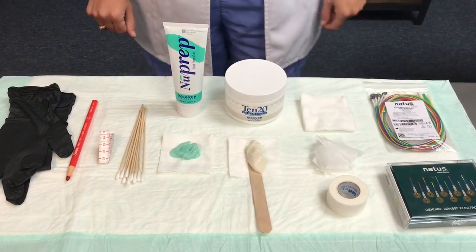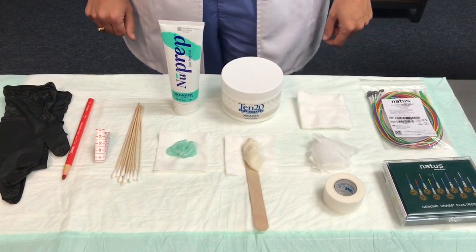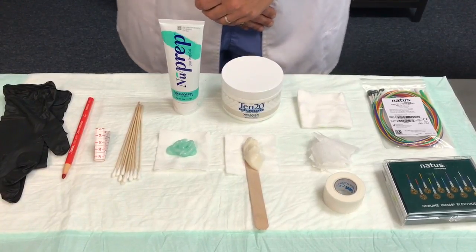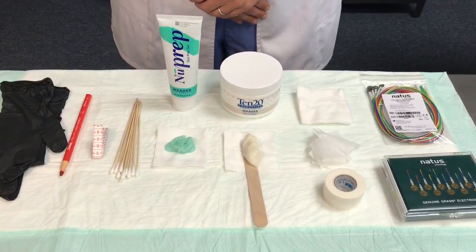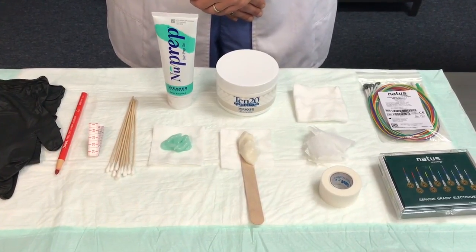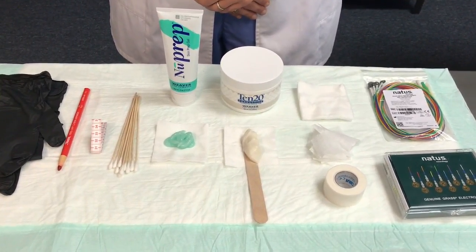Additional supplies include hair clips, gauze head wraps, and ear clip electrodes. The selection of materials in preparation of the patient plays a crucial role in achieving good EEG signals. I'm going to provide a step-by-step application demo. I recognize that materials and processes may vary by country, region, placement method, and personal preference.